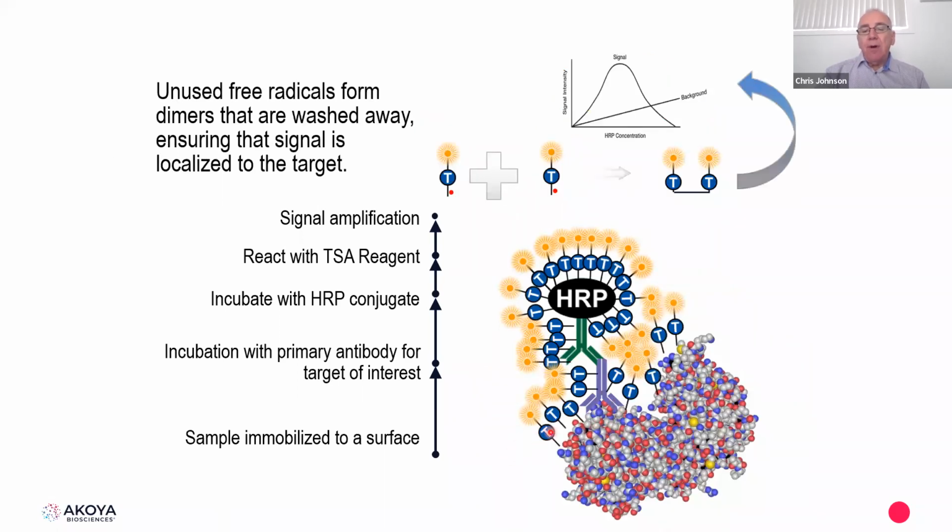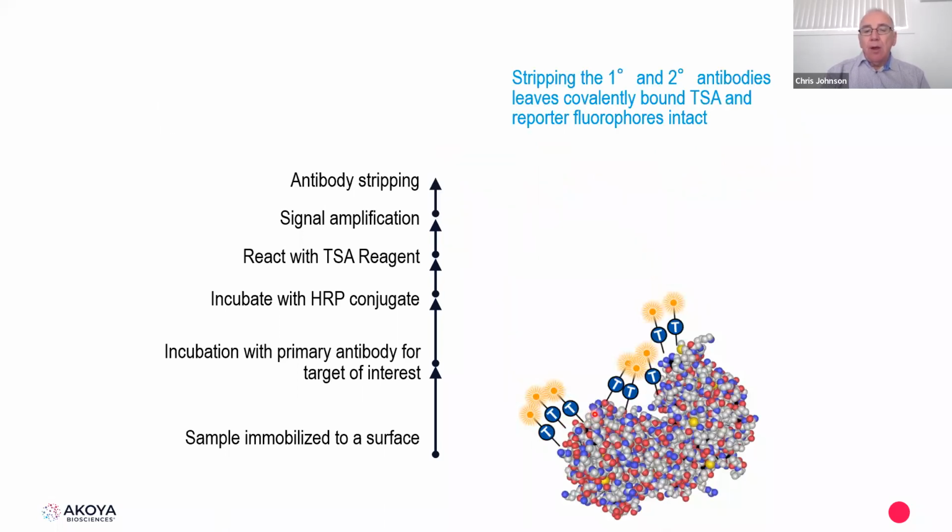The binding of tyramide to the protein is not a van der Waals force reaction. It's actually a covalent bond, so it's significantly stronger in attachment than the weak van der Waals. So when we apply energy through heat, maybe a microwave to cause molecular vibration, or maybe some other heating method, then the very weak van der Waals forces will break, and then we can wash away the complex of primary and secondary.